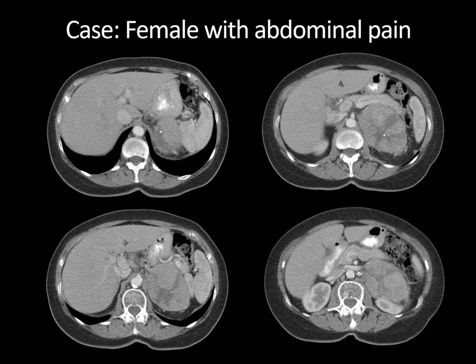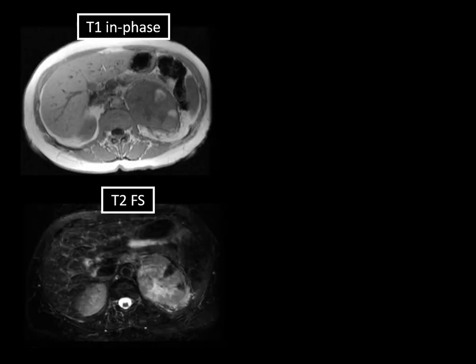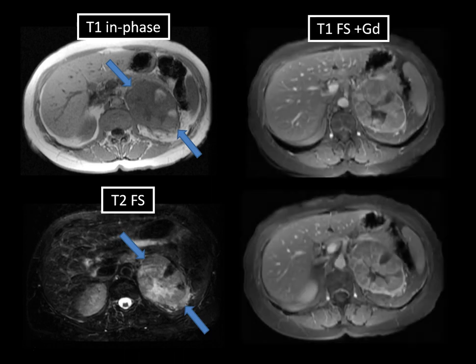Let's move on to a different malignant adrenal mass. This was a 73-year-old female who presented with abdominal pain. There's a very large, heterogeneous left adrenal mass with a few areas of calcification. On MRI T1 and T2-weighted images, the mass has areas of internal T1 hypointensity and T2 hyperintensity fairly isointense to CSF, consistent with fluid indicating central necrosis. These wedge-shaped peripheral areas indicate hemorrhage. Both the areas of hemorrhage and central necrosis do not enhance on post-contrast images, but the surrounding bulk of solid tumor does.